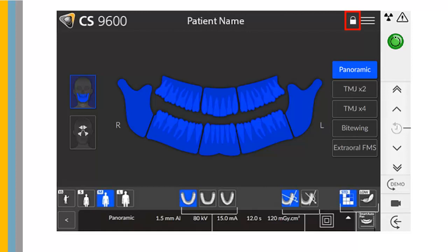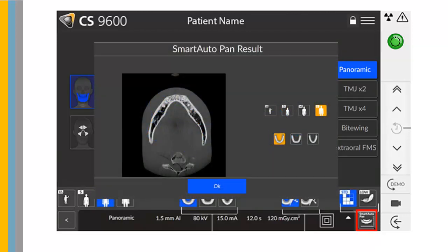Screen Lock is also available on the panel. Smart Auto Pan is an optional 2D function that will scan the patient and recommend patient parameters. Recommended parameters are displayed in orange. If you change the Smart Auto Pan results, the settings will be underlined in orange and the newly selected parameters will be shown in blue.